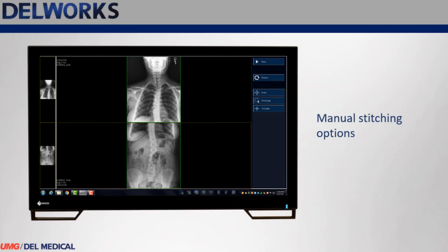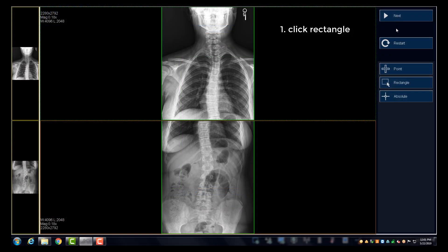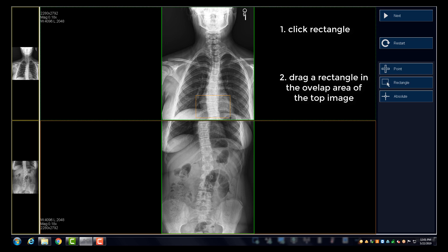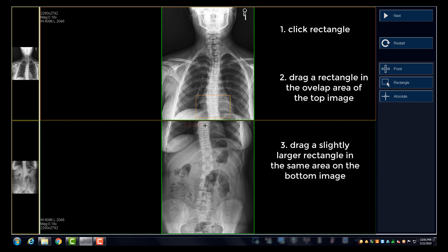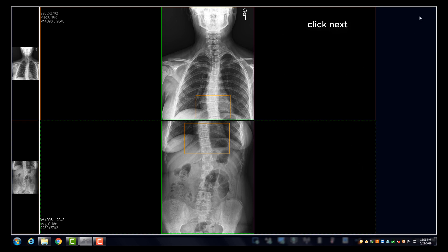Dell Works also allows you to stitch manually three different ways. With each method, you identify two like areas on the images. With the rectangular method, select Rectangle, then draw a rectangle on the top image and a slightly larger rectangle in the similar area on the bottom image. Then click Next to stitch the images together.